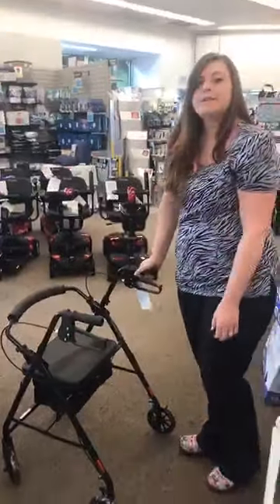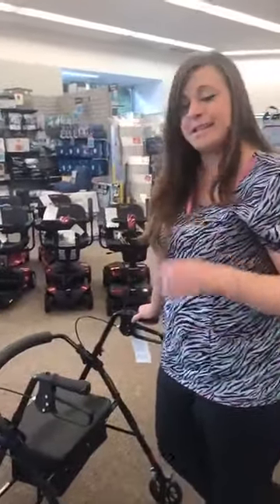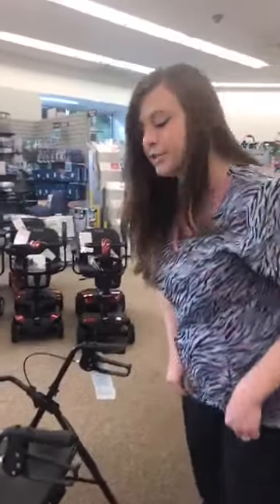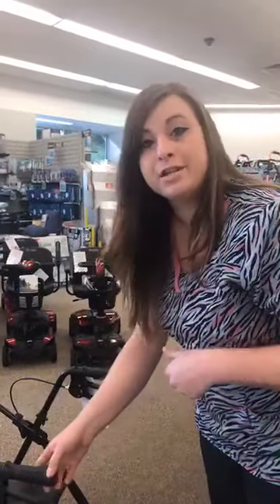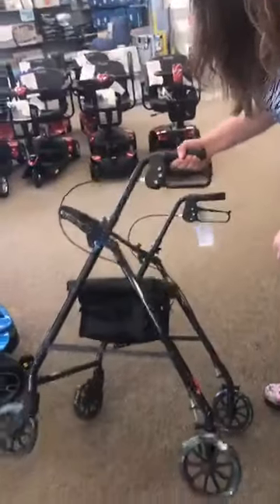Now, same thing with brakes: over time, because they're like a bicycle brake, they can loosen, and sometimes they need adjustments. And again, we can do all this for you here at Lambert's. Just give us a call. One of our service technicians can set up an appointment to adjust this for you. But I'm going to show you real quick how to do that if you're able to do it at home.